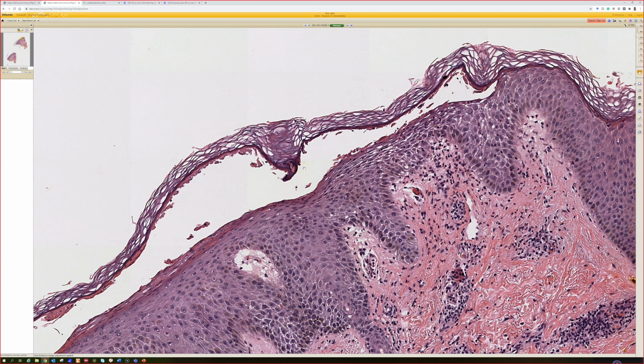But you're absolutely right. And I'll tell you what, from this slide, I cannot distinguish between those three diseases. In fact, this is labeled as bullous impetigo, but I did not find any evidence of bacteria or neutrophils in the split here. That happens sometimes where they wash out during processing. But normally, to confidently diagnose bullous impetigo, I need to see bacteria in the blister cavity, or at least neutrophils usually. Pemphigus foliaceus and staph scalded skin are usually devoid of inflammation and, of course, devoid of bacteria.